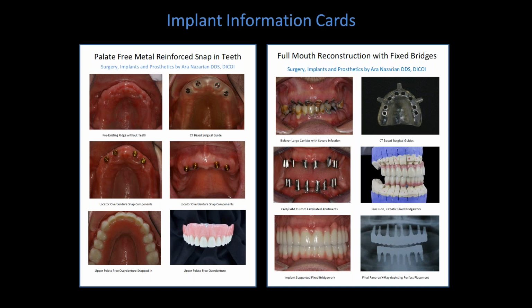Also, we'll educate them with these implant information cards so they can clearly see and understand with these photos what's involved in the different types of treatment that are available.